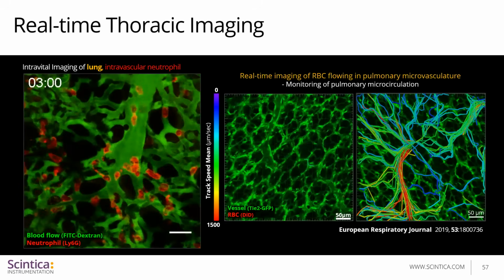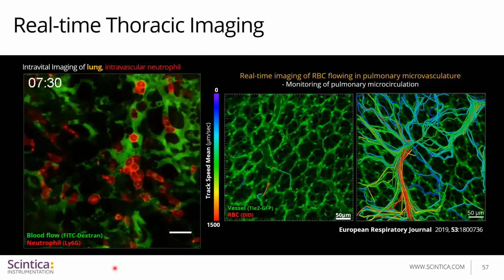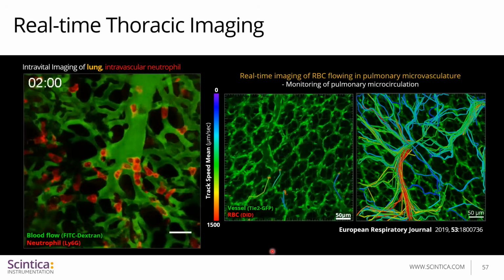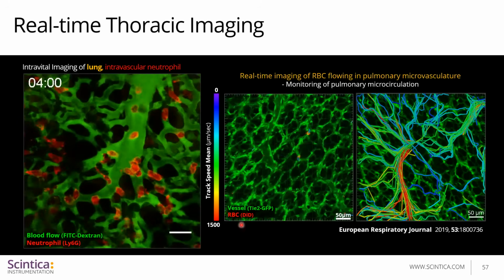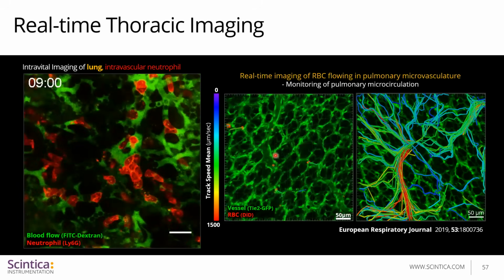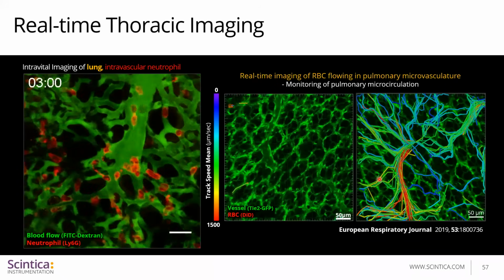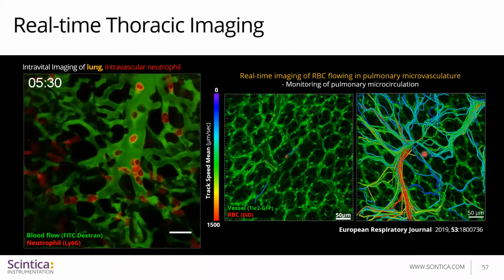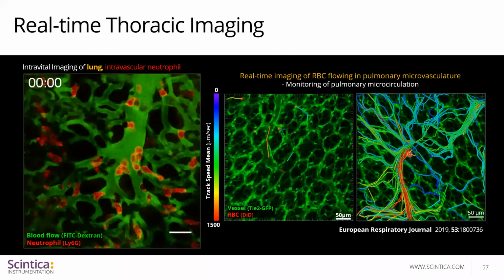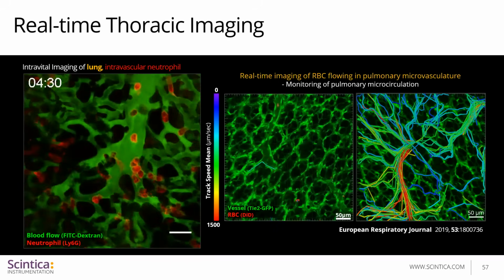And this will not only help with the imaging, but also with the mouse breathing. For example, by imaging red labeled neutrophils in the pulmonary microcirculation, you can evaluate the level of sepsis in the lung. You could also interest yourself in tracking red blood cells in the lung microcirculation. And in post-processing, you can then analyze the path of these red blood cells and their track length, as well as their speed, with red being faster moving to green being slower moving red blood cells.